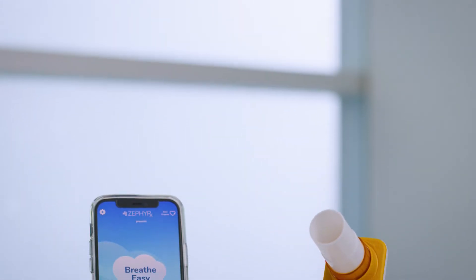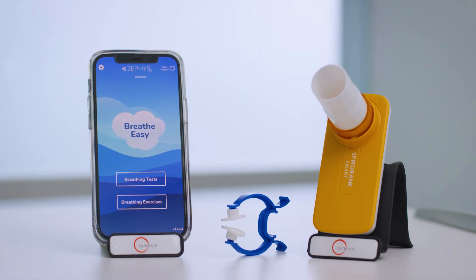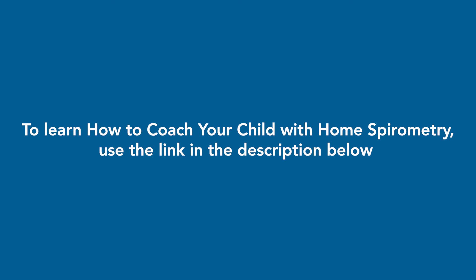This video demonstrates how to perform home spirometry using the Mir SpiroBank Spirometer and the Zephyr X Breathe Easy app. If you are a parent or caregiver and want to help your child do home spirometry, please watch the video on how to help a child do home spirometry.